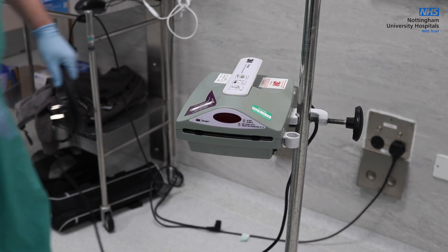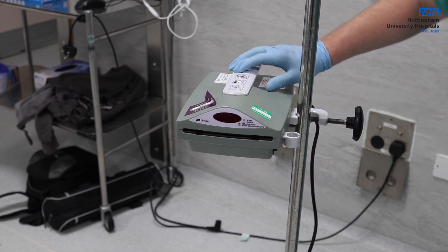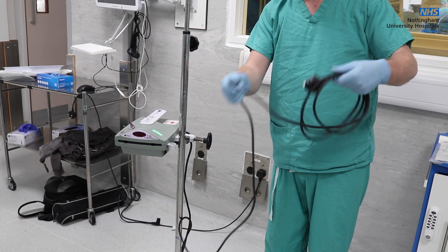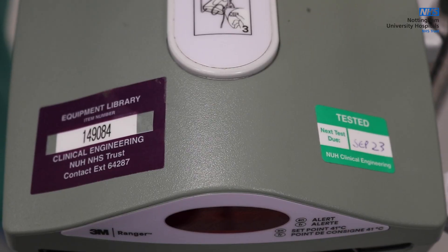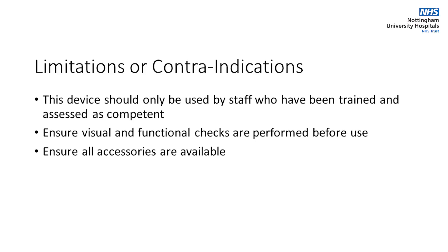To check for damage, wear and faults, check for obvious signs of physical damage to the Ranger. Check the service sticker to ensure the Ranger is within its service period. This device should only be used by staff who have been trained and assessed as competent, as per the NUH medical devices training policy.